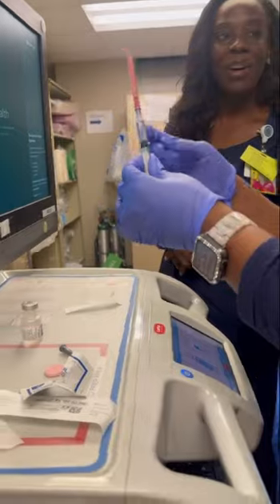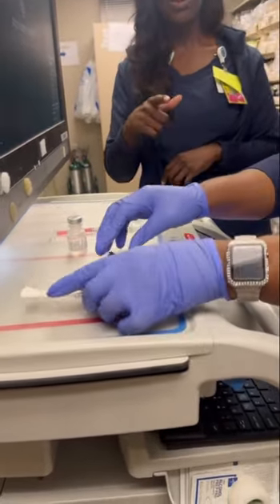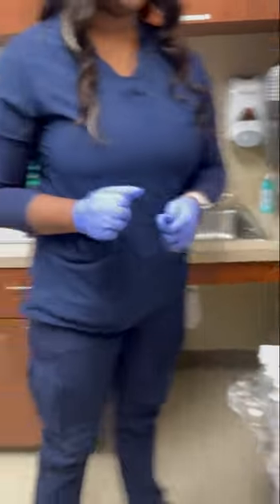Do you feel comfortable with that amount? We can place it back down, discard all waste, and put whatever needs to be placed in the sharps container into the sharps container. Thank you so much — great job.